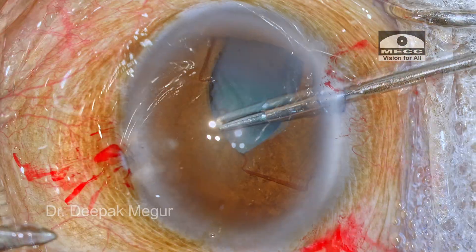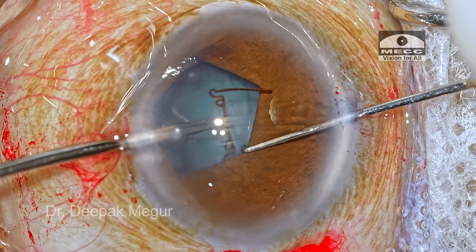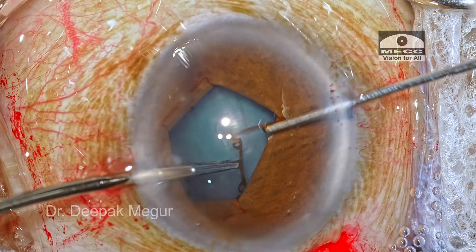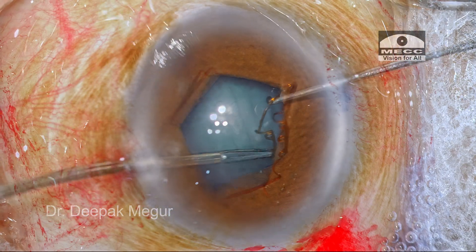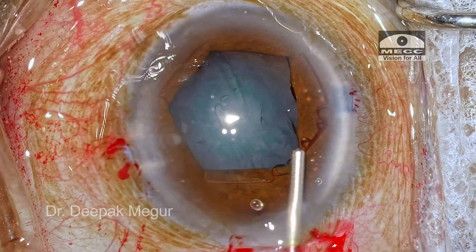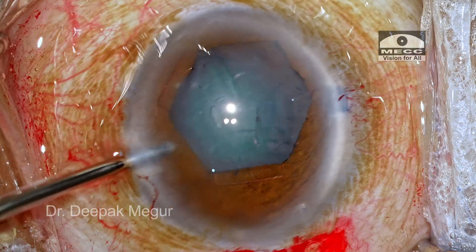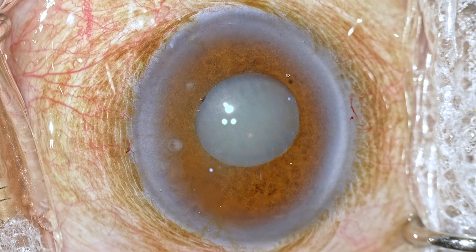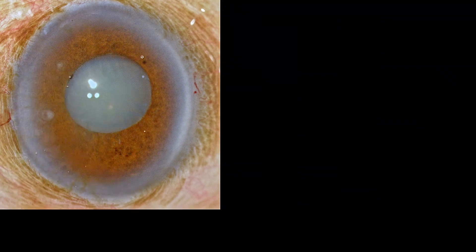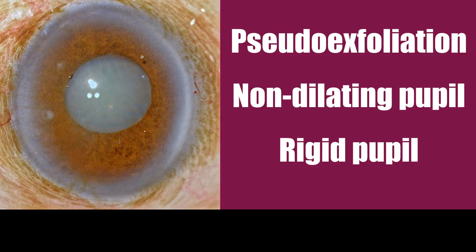I would like to share an unusual incident which can happen when you're using a B-Hicks pupil expansion device in a rigid pupil. I want to share this experience so that it can help many young budding surgeons, and there's a very simple hack to deal with it. This is a 75-year-old gentleman who has pseudo-exfoliation and a non-dilating, rigid pupil.